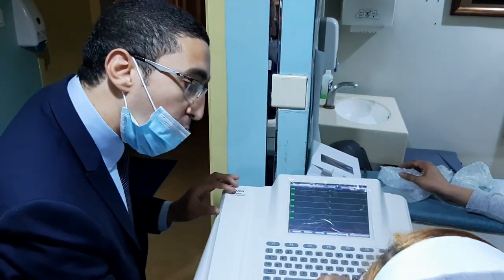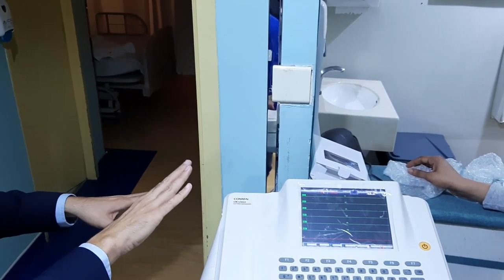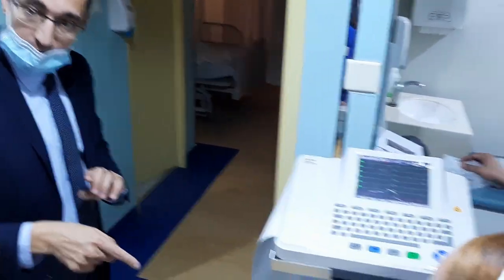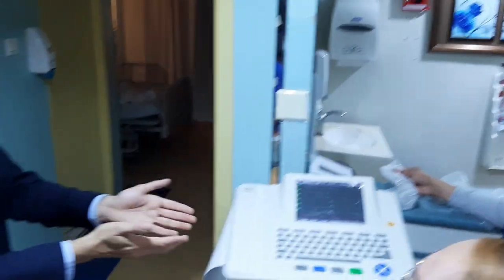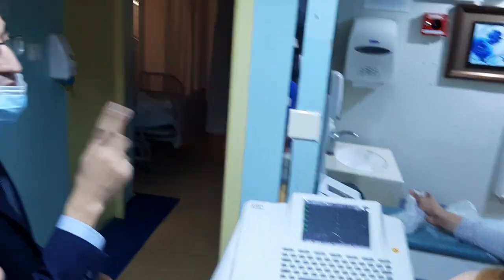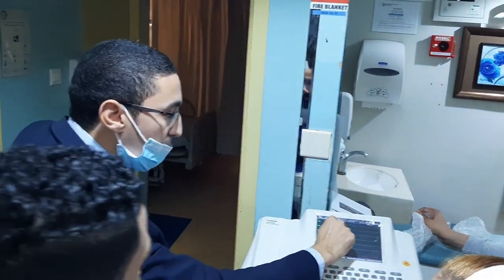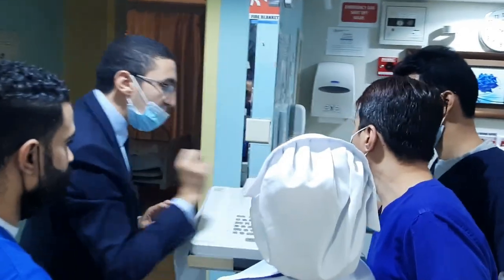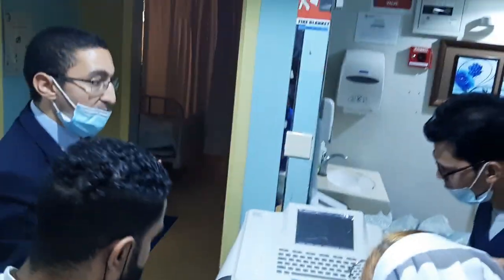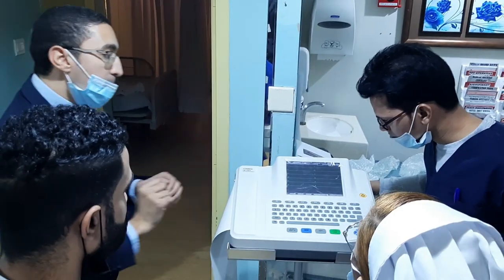So you will record on start. It will be recorded continuously until you stop. Some doctors want this one. So okay, 3 minutes, no, 4 minutes, something like that to check more. Continuously. So this is semi manual. You stop. So this one is manual. But what about automatic? Automatic is this one. It will stop automatically. Manual means you will stop by yourself.